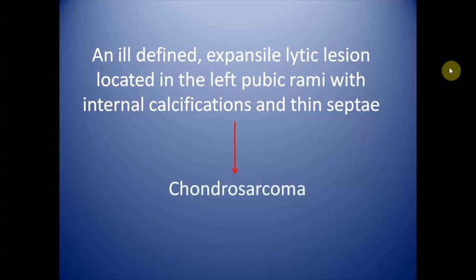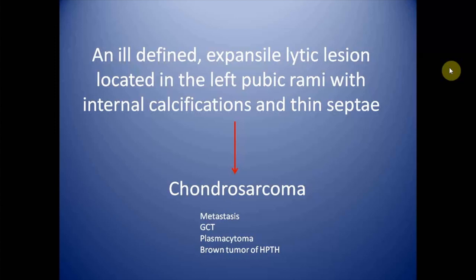This is the case of chondrosarcoma. The differential diagnosis includes metastasis, giant cell tumor, plasmacytoma, and brown tumor of hyperparathyroidism. Metastasis is excluded based on absence of other skeletal lesions and no known primary. Giant cell tumor can be kept as a differential. Plasmacytoma presents as a solitary osteolytic lesion but would not have internal calcification. Brown tumor of hyperparathyroidism is excluded based on absence of other skeletal features of hyperparathyroidism.